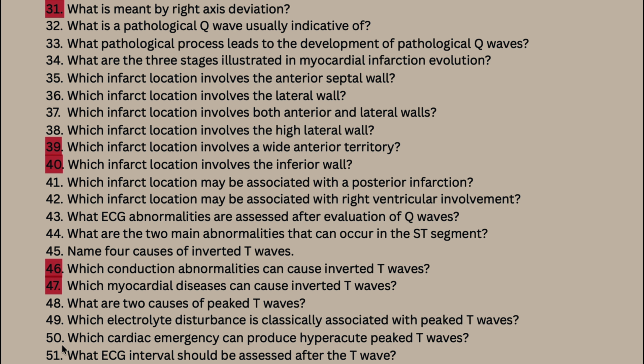Let's do one more question. For this one last explanation, we'll cover all these last questions. Why is patient identification important before interpreting an ECG? Patient identification ensures that the ECG belongs to the correct individual, and this quite simply helps prevent potentially serious diagnostic and management errors.